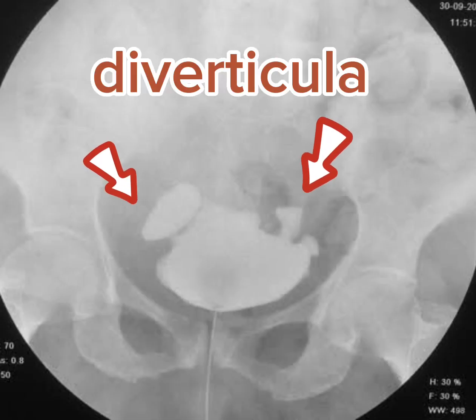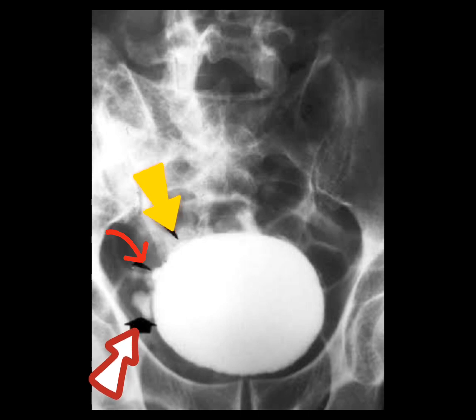This is an example of IVU examination where we can see the urinary bladder filled with contrast and there are multiple diverticula along the roof of the urinary bladder. Another example shows a cystogram where contrast fills the urinary bladder, showing multiple small diverticula along its roof and right wall.